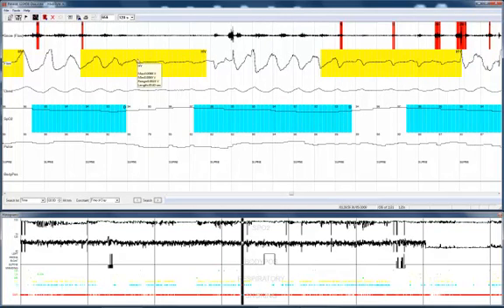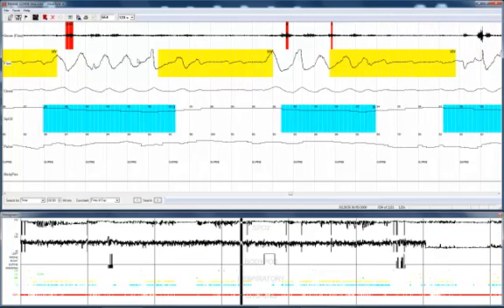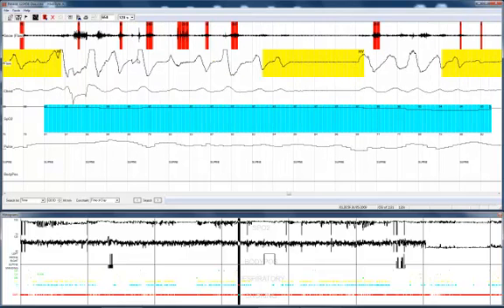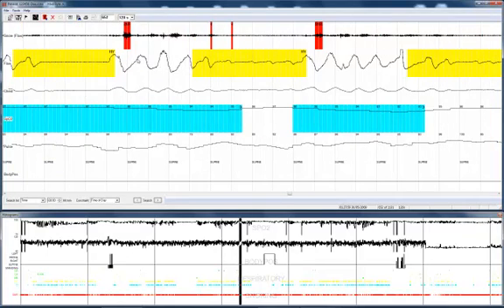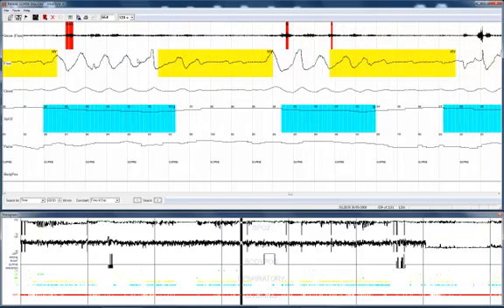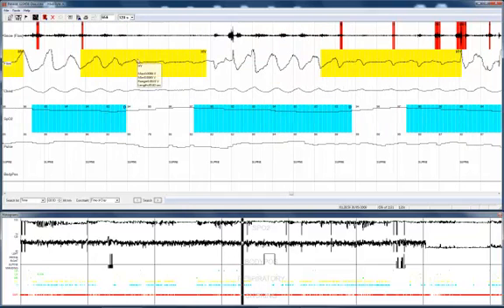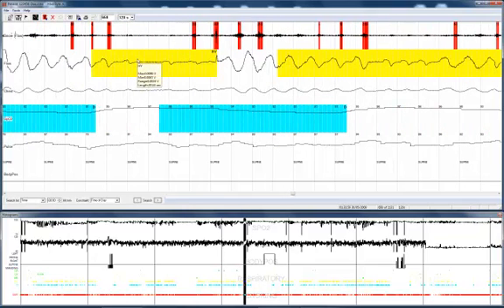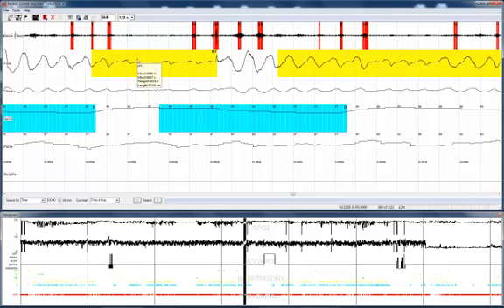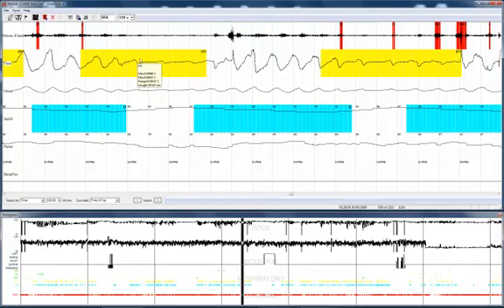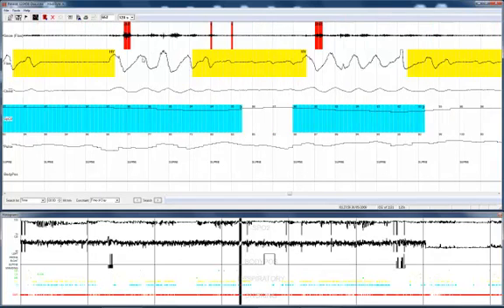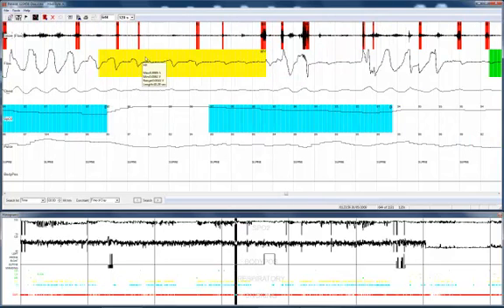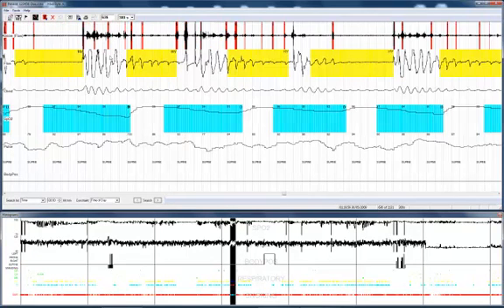An arrow press upwards, an upward arrow press, moves you half the display width back in time. And a down arrow press moves you half the display width forwards in time. You may also use the control page down key or the control page up key for the same operation. Alternatively, you may choose to use the mouse wheel or the wheel on your mouse to navigate around the screen, which is what I'm doing right now.